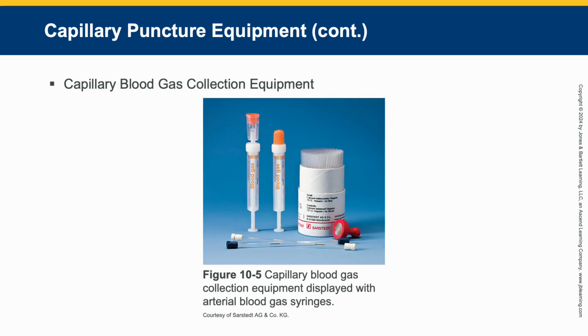All right, this is just an up-close picture of the capillary blood gas collection equipment. You've also got the little caps that go on the end, and the blood gas syringes. All of that is what you would use for a capillary blood gas.